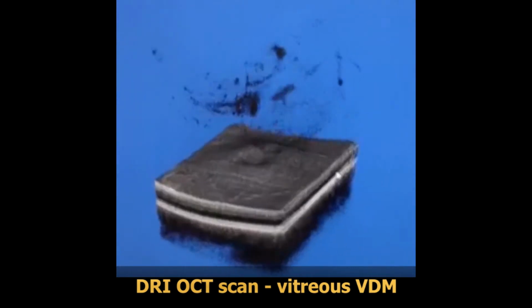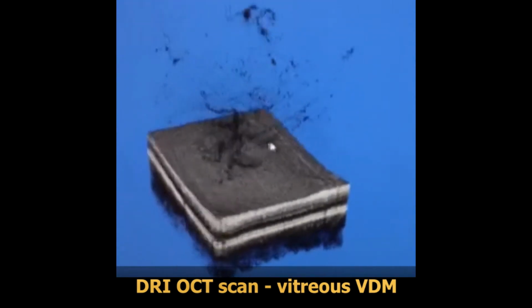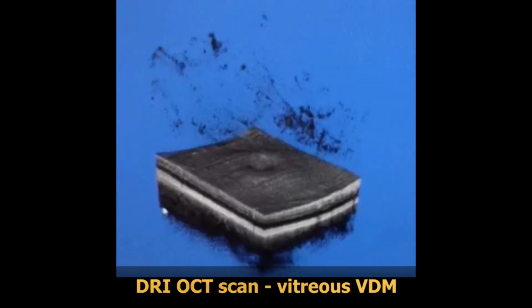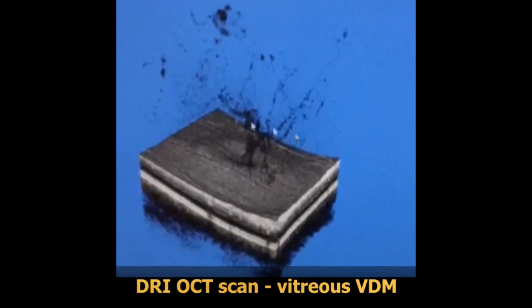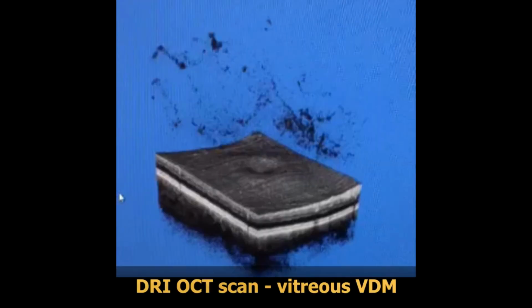In front of the macula, you can see many dark structures which represent opacities in the vitreous body. In this instance, they are organized in clumps as well as linearly, and this is most likely the result of myopia or some inflammatory condition of the eye, as well as some effects of aging, although this is not the typical appearance of an aged vitreous in an elderly individual. These structures will interfere with the passage of light to the back of the eye and create shadows that will be seen by the patient as floaters.